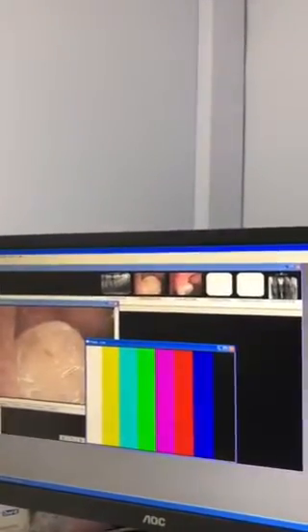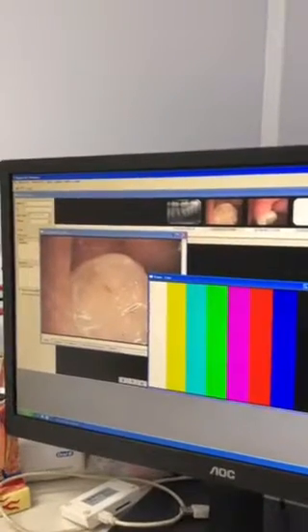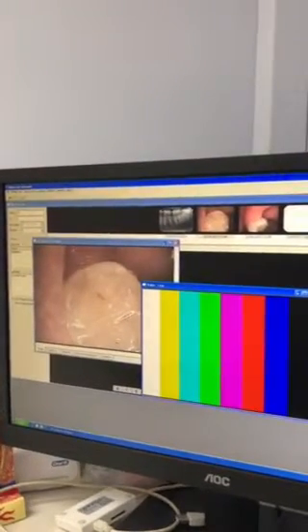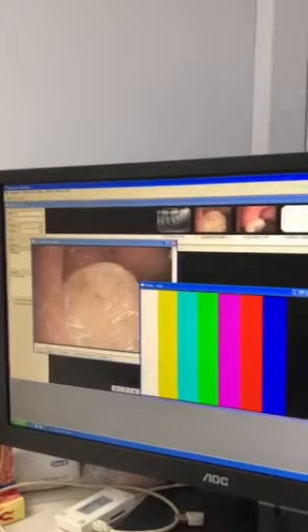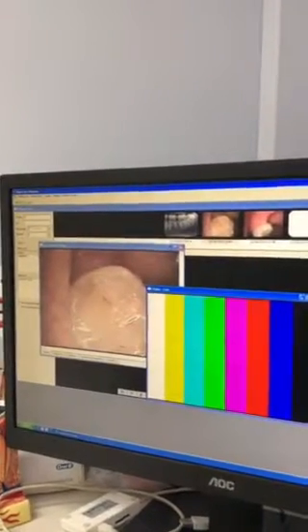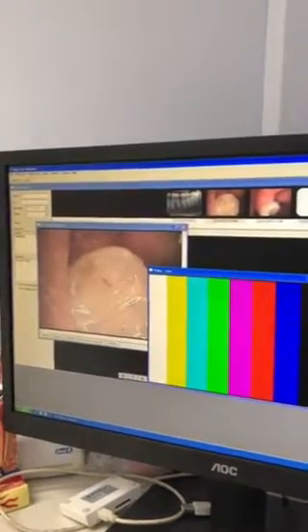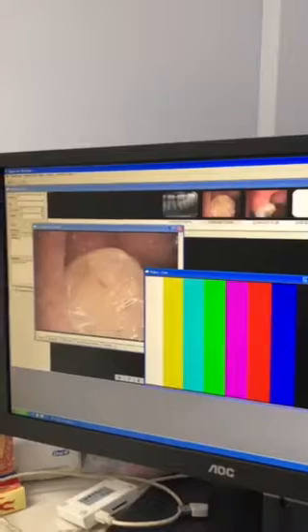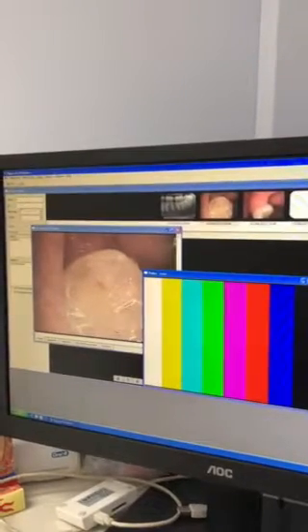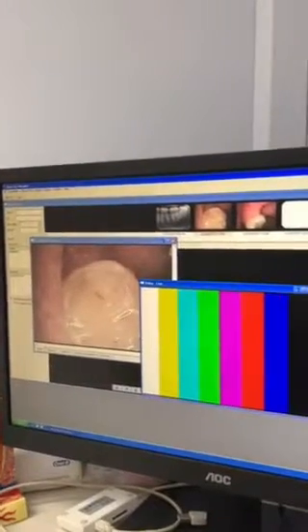The imaging with regard to video is extremely important when gaining consent from patients, explaining their treatment to them so that they understand. If somebody can see what's going on, it's much easier to visualize what kind of treatment they require, as well as what can potentially be achieved, as well as showing them before and after pictures and things like that.